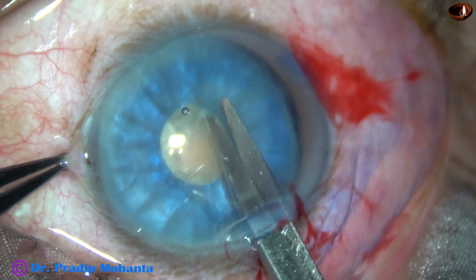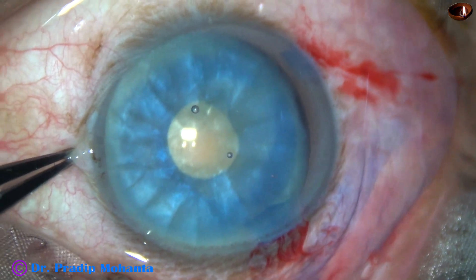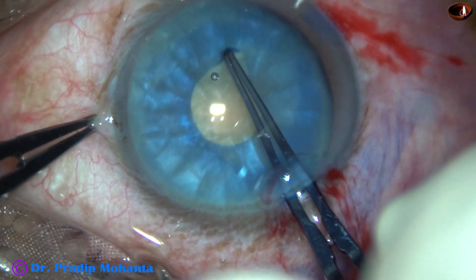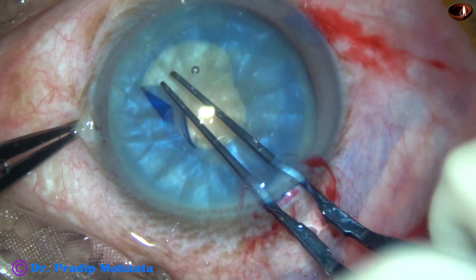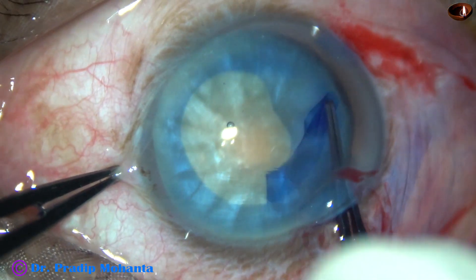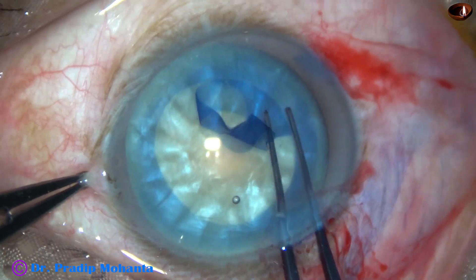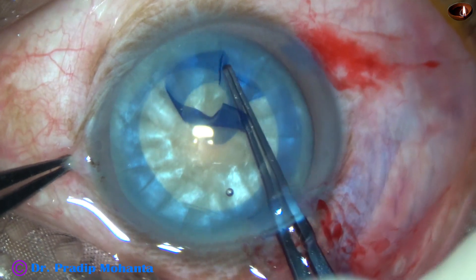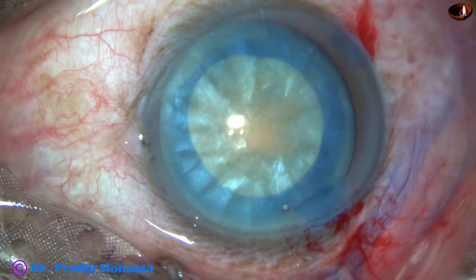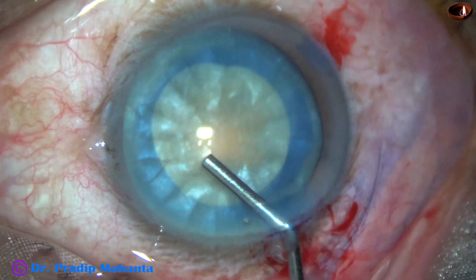Now, I take a Vannas scissor and make a small cut at the margin of this mini-rhexis at around 7-8 o'clock. Then I use utrata forceps again and enlarge the mini-rhexis into an optimum-sized rhexis. This gives a nice 5.5-millimeter or 5.25-millimeter rhexis.